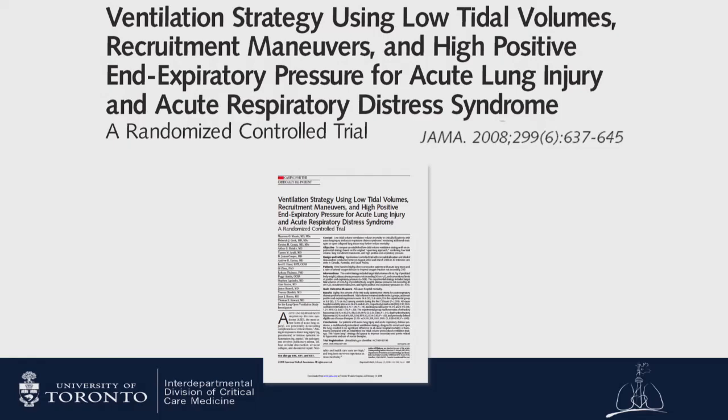And this is something that we're just appreciating with new technology called electrical impedance tomography, which shows that when the lung is injured, I mean, this doesn't happen in normal lungs, but when the lung is injured, when spontaneous efforts are combined with positive pressure, this can lead to the breath being delivered into the lung in such a way that almost all of it goes to the bases first, and then it comes back up to the top.